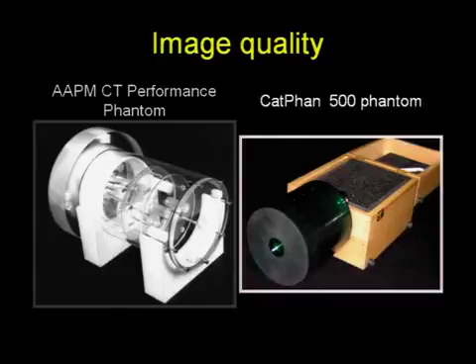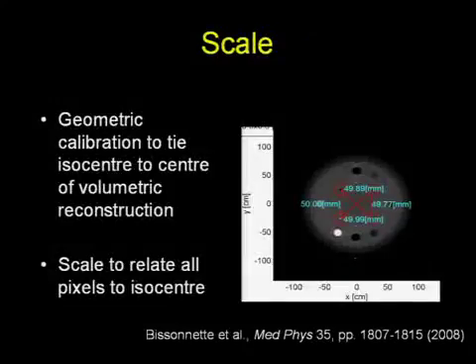The phantoms can test for the same things I'll be talking about. So the first thing I want to talk about is scale. Scale is essentially making sure that objects of a known size or distance apart are imaged and that the images tell you the same distances.